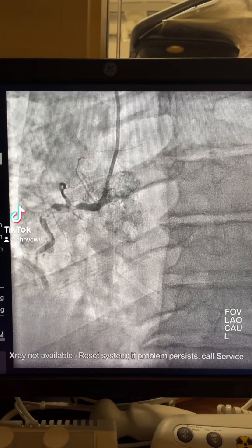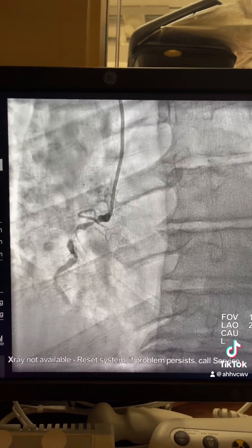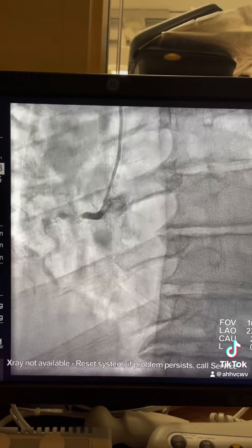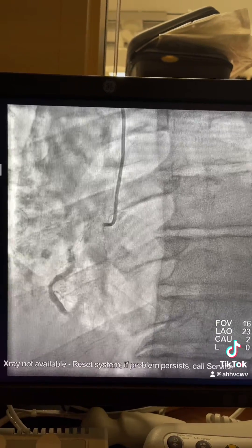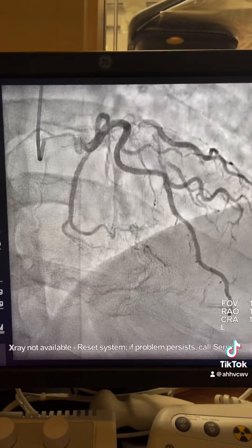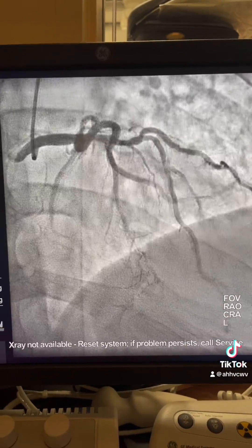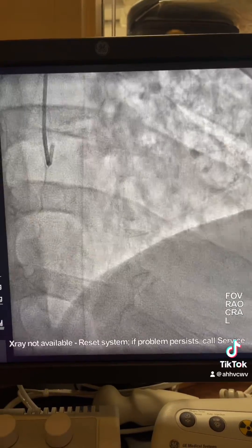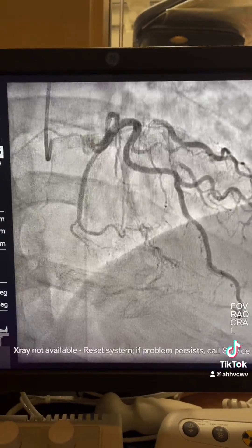The second CTO for today: radial case, occluded RCA, outpatient referral, left system. Had some disease in the LAD diagonal but well collaterals to the RCA.